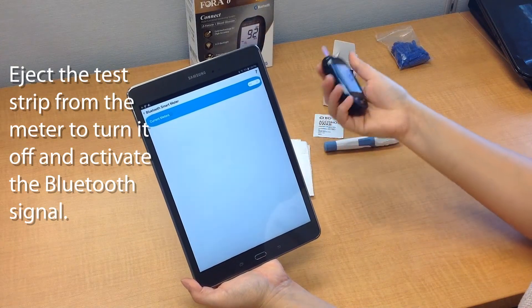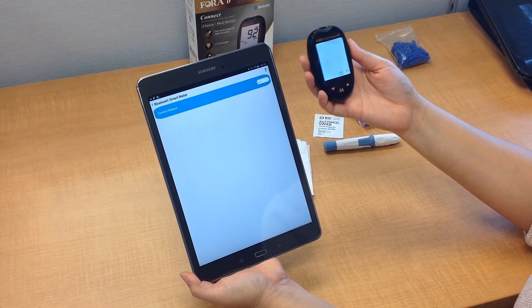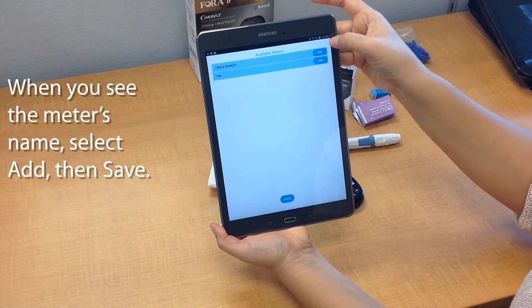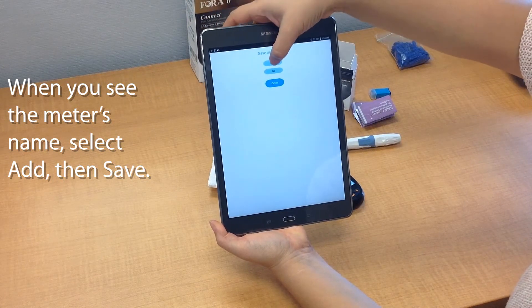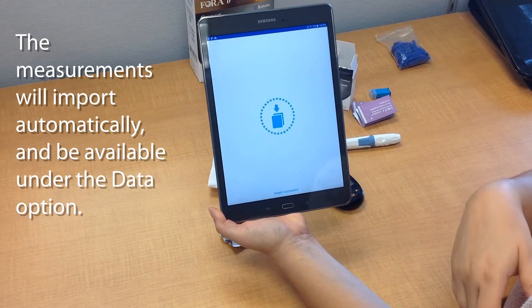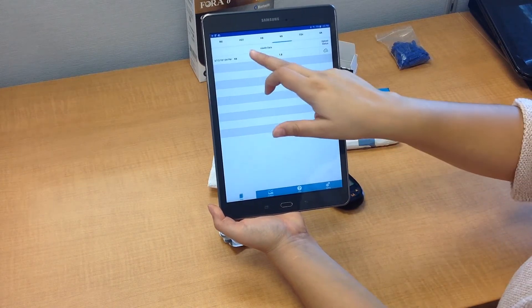Take your device — you see this little eject button? Press it to eject the test strip. Push it up and the meter will automatically turn off, but it will also activate the Bluetooth signal, which enables your smart device to search for the meter. You'll see the name Fora 6 Connect come up. Tap on Add, then go back. You'll have an option to save — say yes — and that will automatically start the importing process. All of your results will start importing in. Import successful. Once done, all of the results can be reviewed under the data/KB section of the app.